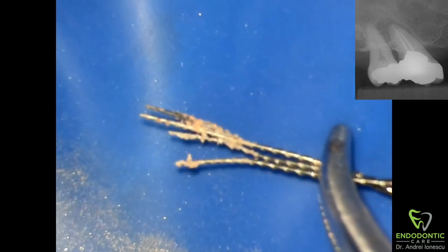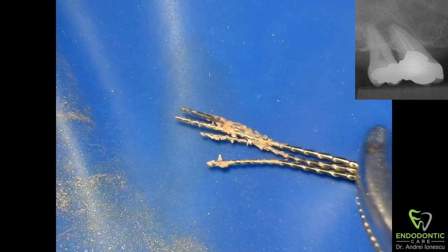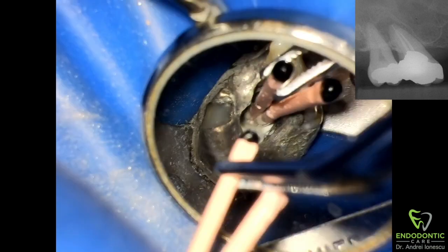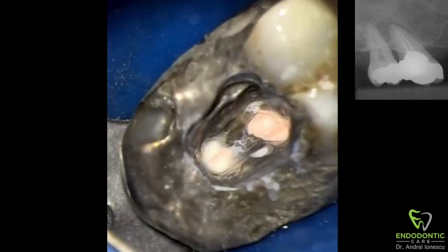And there you go — you can see three Hedstrom files and the thermofill carrier. That was the hard part. Now this is what we have inside the pulp chamber: lots of debris, which of course we need to clean out. In this case we also had to look for the distal buccal canal, which happened to be originating from the same orifice as the mesial buccal, just separating a little bit further down. Once the gutta-percha and carrier were out of the way, I could look inside with the microscope and find another pathway. Now we'll go through our irrigation protocols, obturate, and take a final x-ray.